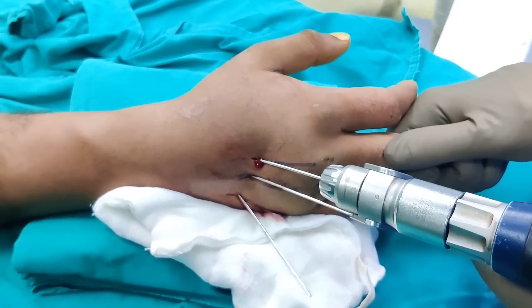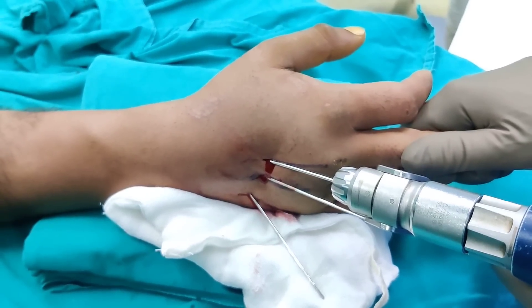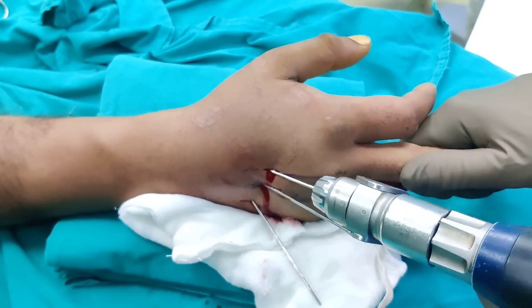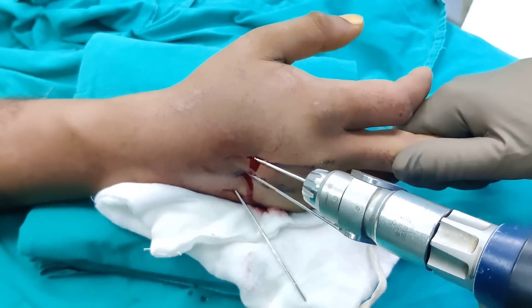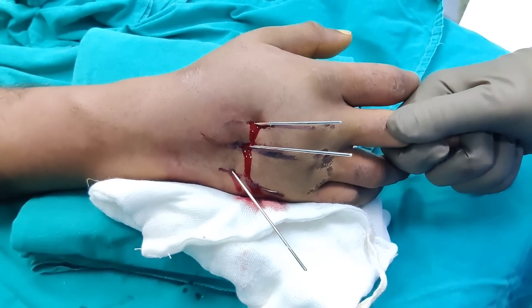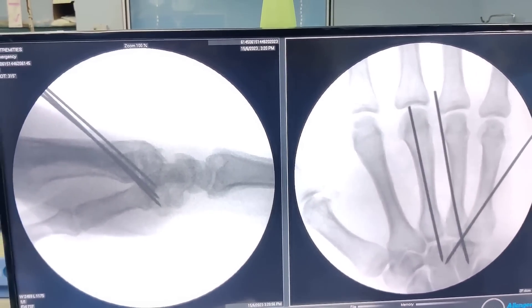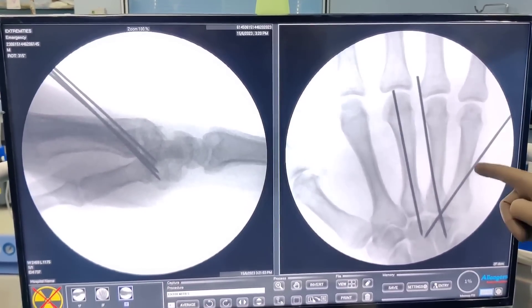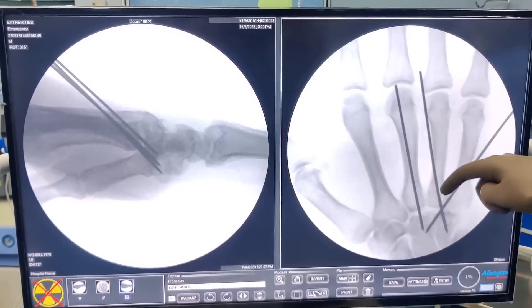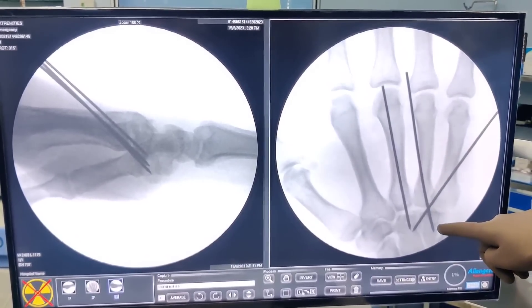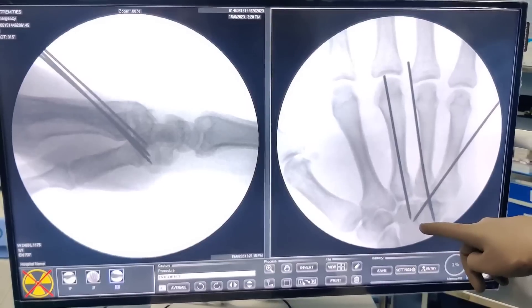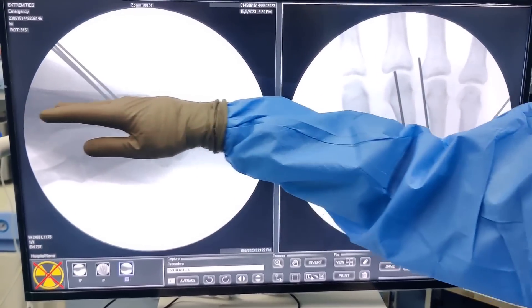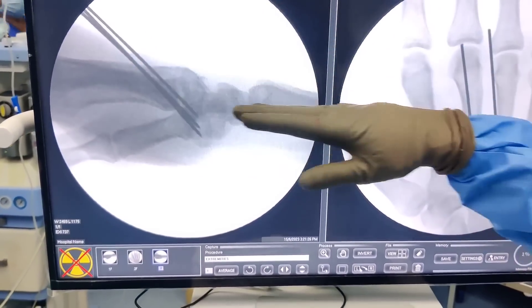The middle metacarpal was also unstable. I am holding the middle finger, giving it traction, and using the other wires as a guide I am passing my third wire. I can feel it is still in the bone — and that looks pretty good. On the AP view you can see that the wire going to the fifth metacarpal goes obliquely, because if you go straight there is hardly any bone to catch. This one goes obliquely to catch the carpal bone, while this one goes pretty much straight into the capitate. On the lateral, everything is now anatomically reduced.